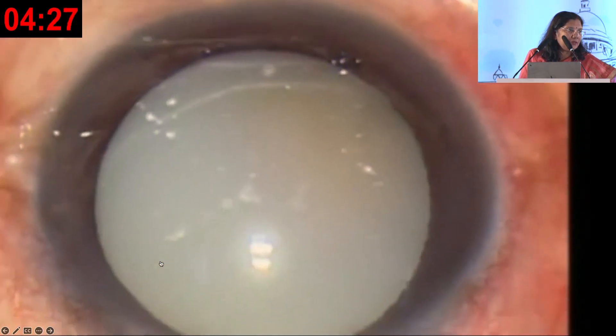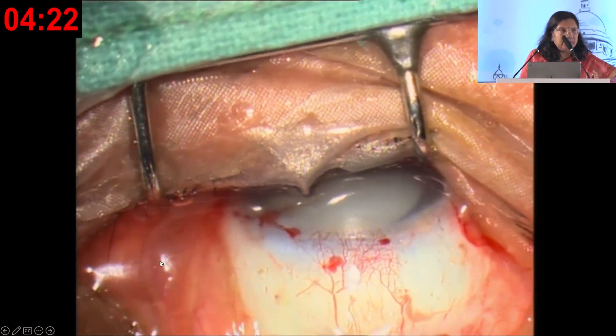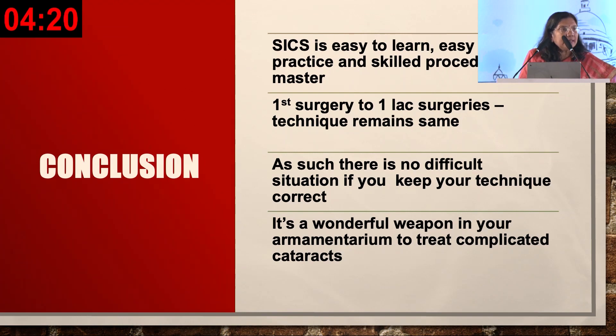Hypermature cataract with the Blumenthal technique — we have already seen the envelope technique. SICS is very easy to learn, to practice, and to master. It is reproducible, there is no difficult situation in SICS, and it's a wonderful weapon in your armamentarium. We are essentially phaco surgeons at medical college and 100 percent SICS surgeons at camp — both techniques can be used for the betterment of patients. Thank you so much.